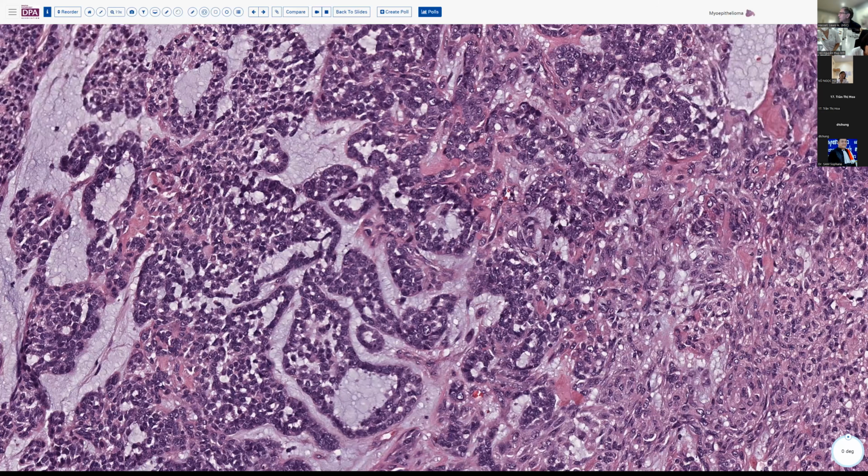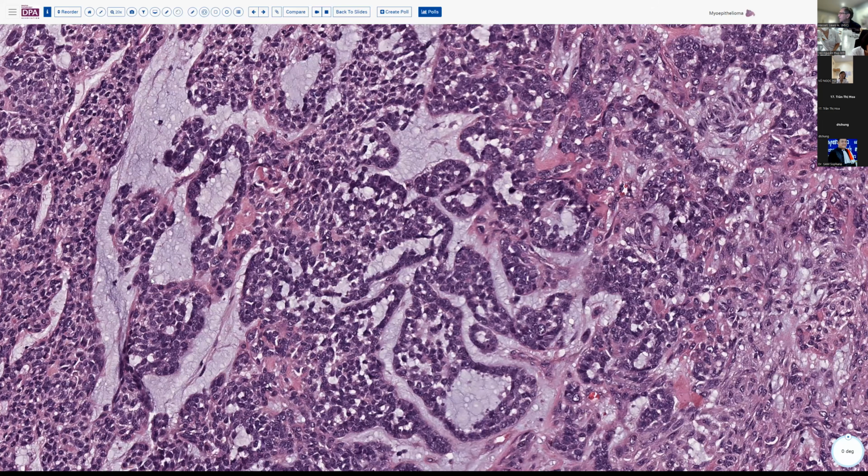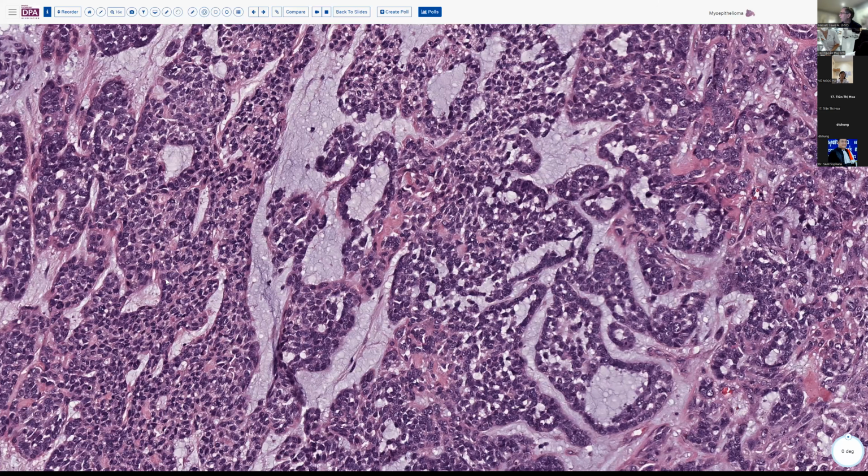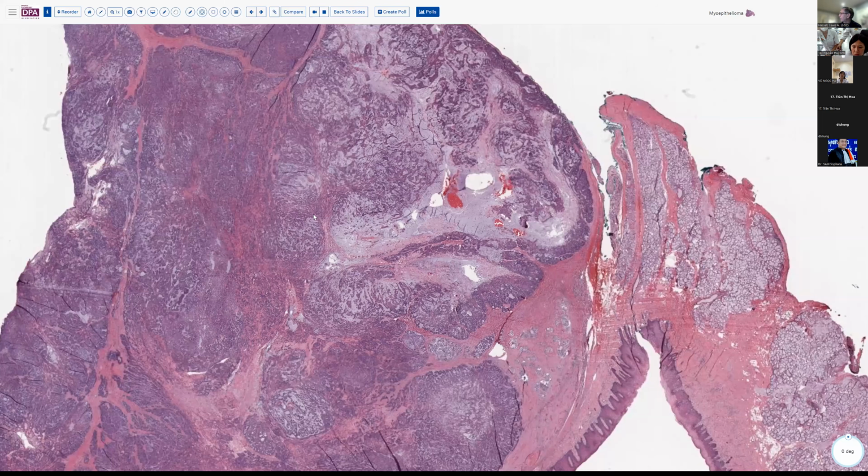And so you could say, well, is this a monomorphic or basal adenoma? But the pattern of the cells and so forth, a little bit of a spindle-ish shape, and your myoepithelial markers should steer you towards a myoepithelioma. Now, of course, this is a fairly large one, and in a minor salivary location, you certainly want to get good local control and make sure that your margins were clear.